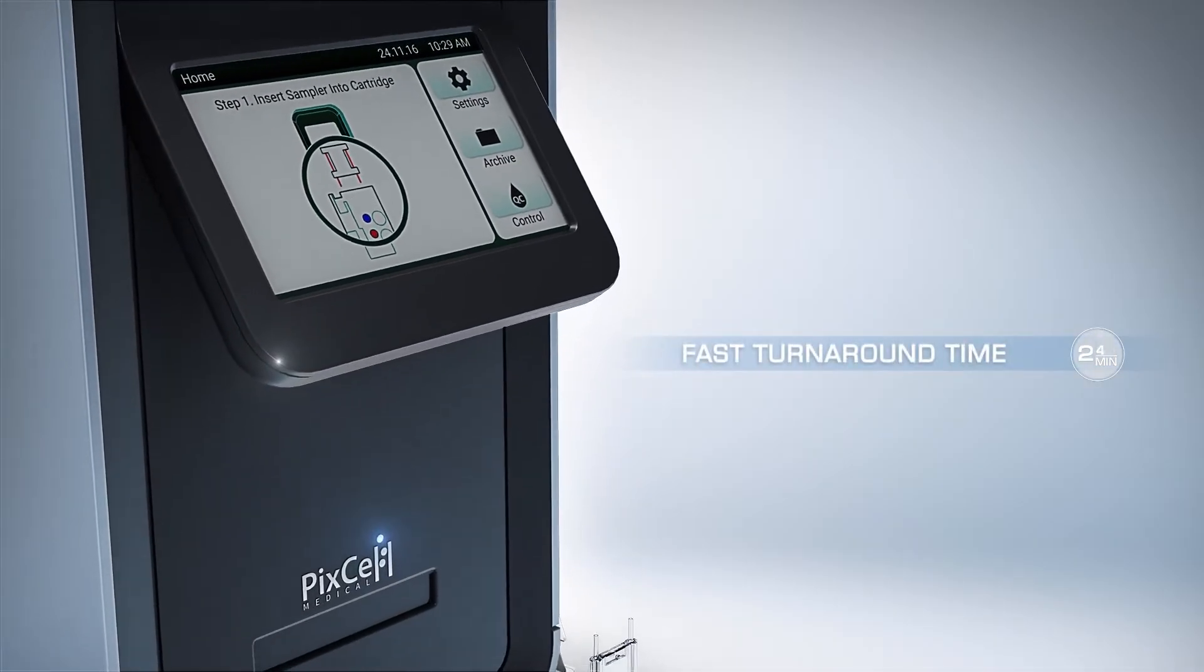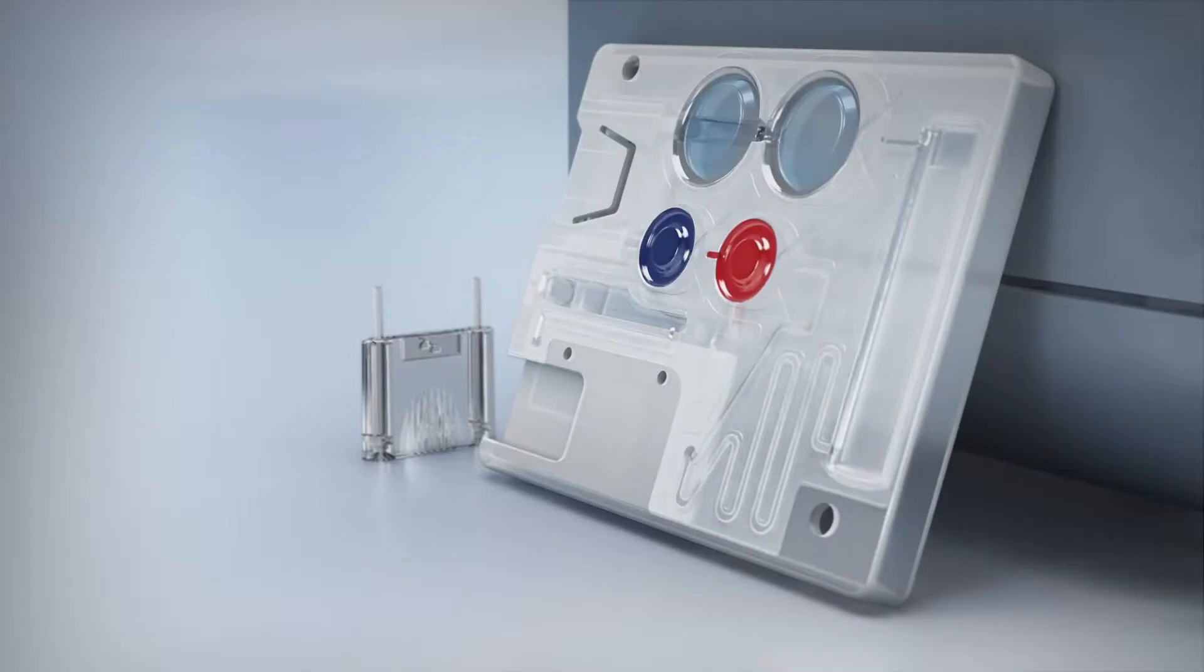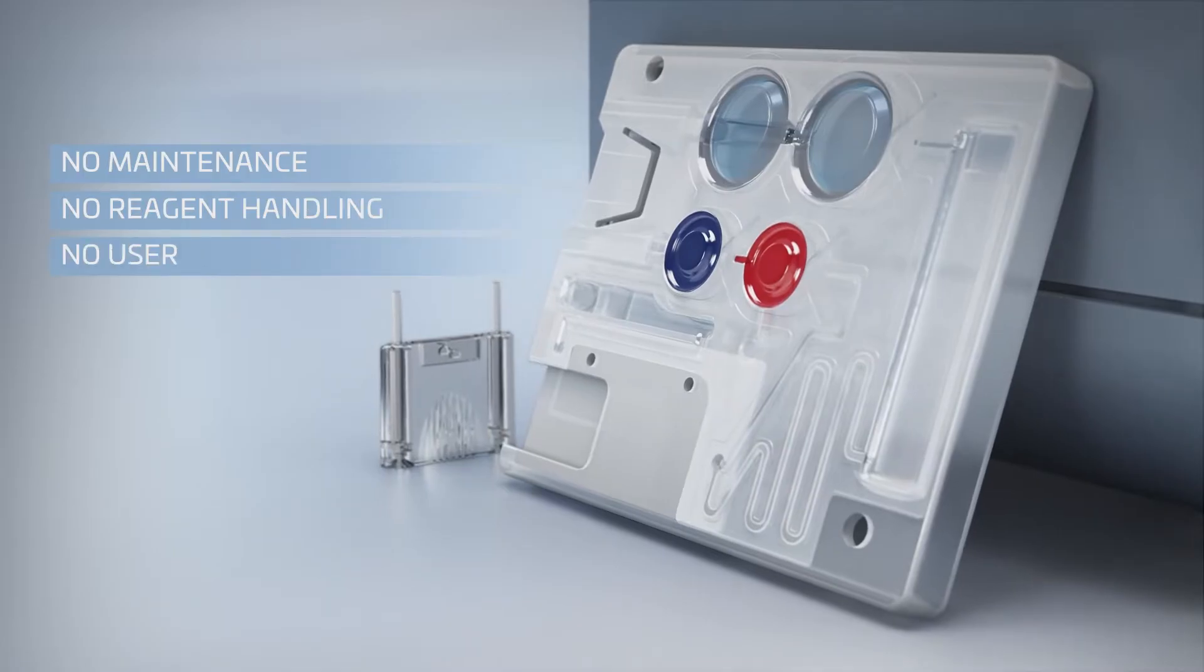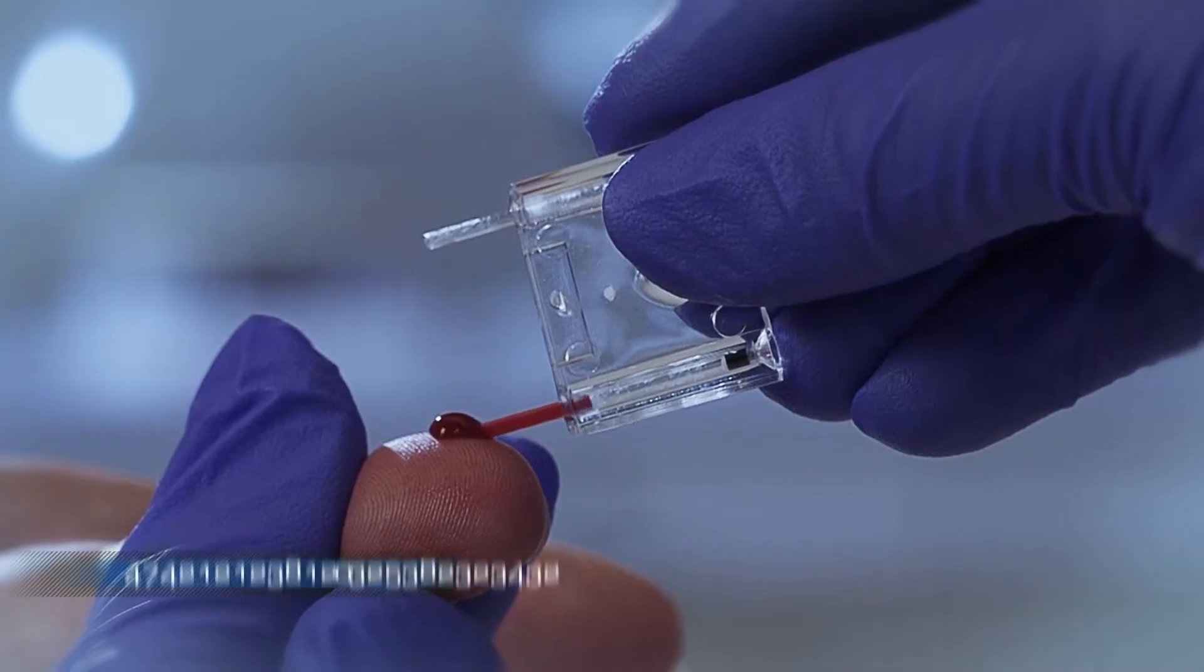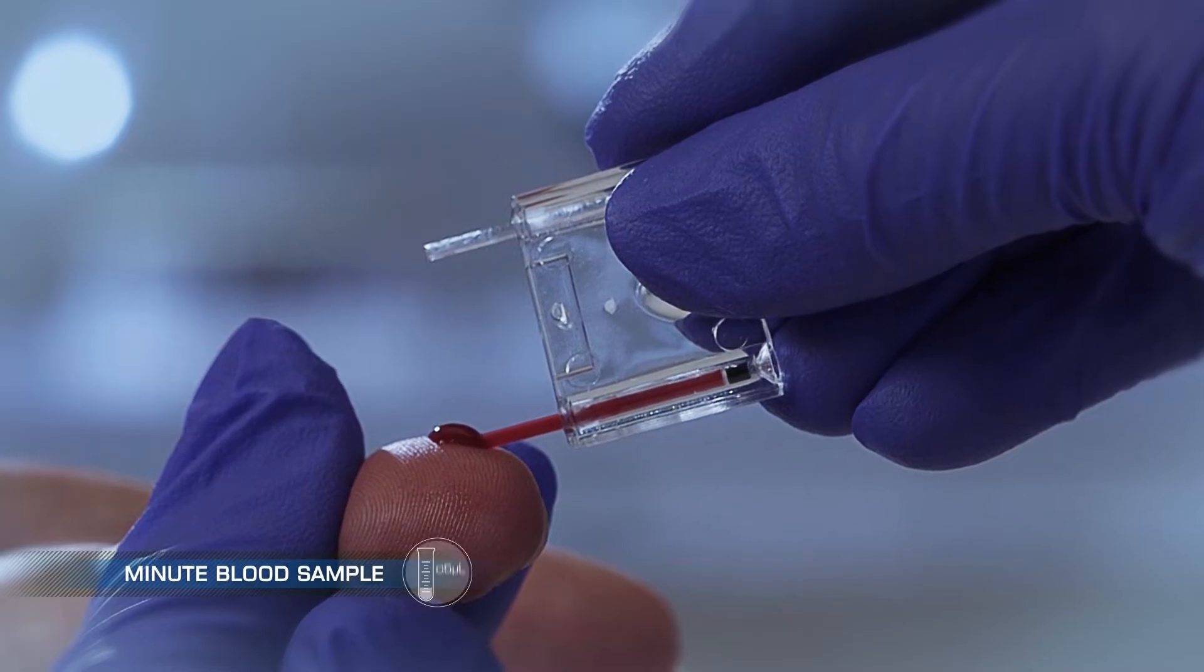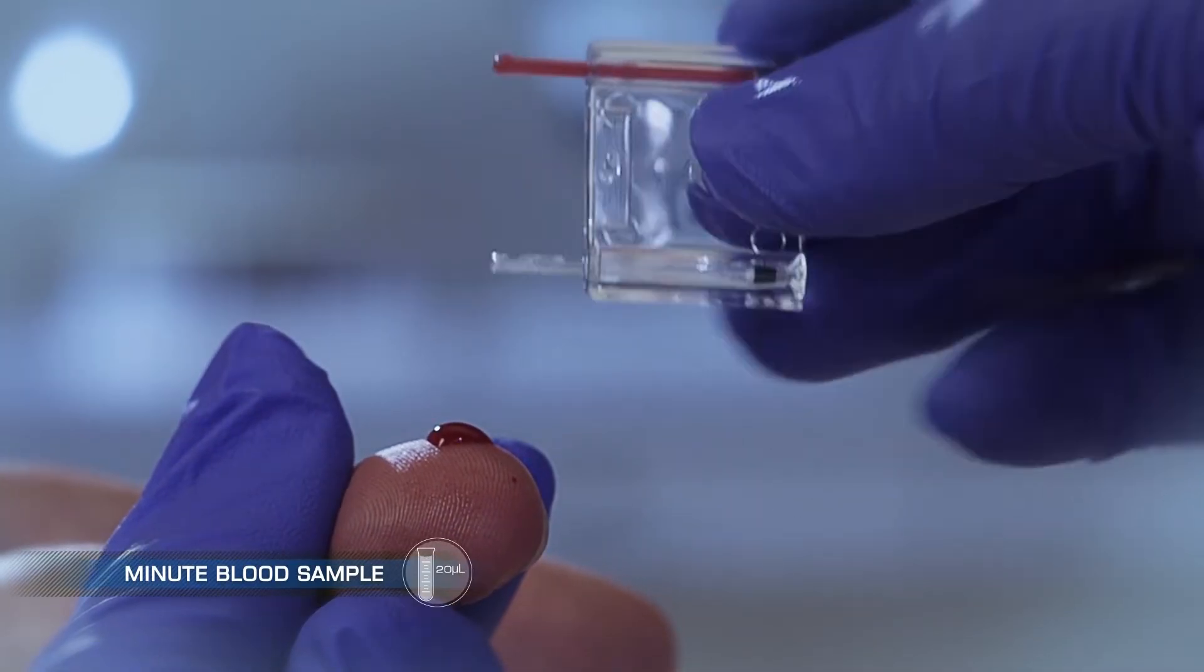Hemoscreen Reader provides immediate results within five minutes. Designed specifically to save time and operating costs, the test has a fast turnaround time and requires only a single drop of blood.